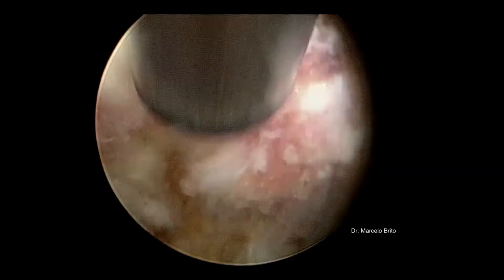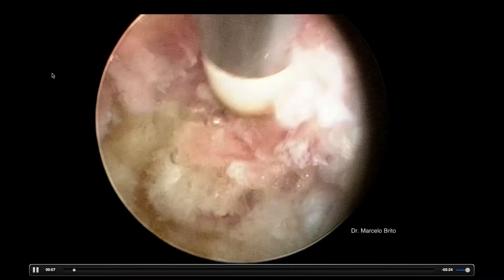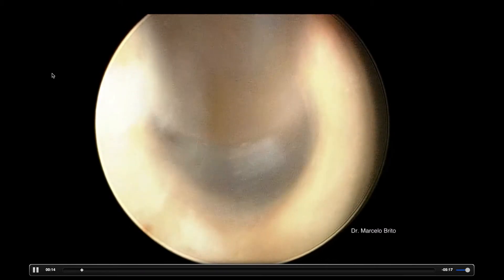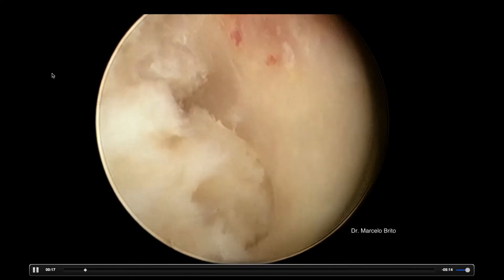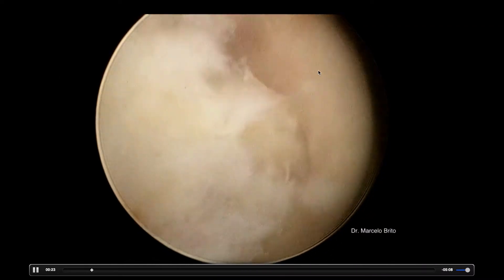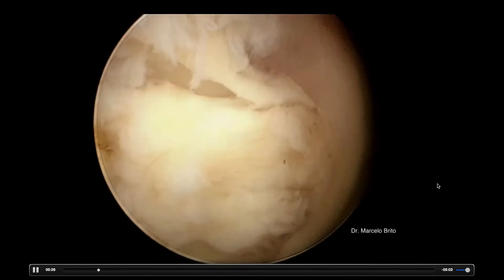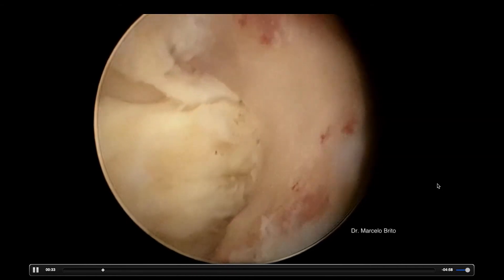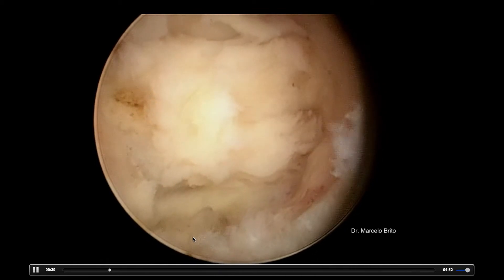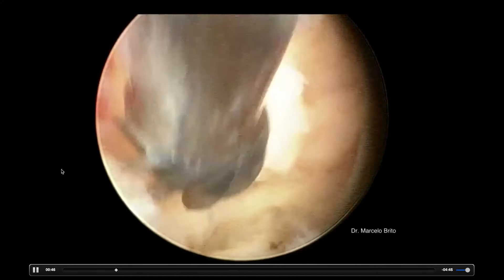This is our first endoscopic image. We're going to get rid of the soft tissues using a bipolar — we're going to coagulate vessels and get rid of muscle and other soft tissues. At 3 o'clock is the upper lamina. We are accessing through the right side, L4-L5. At 6 o'clock we have the facet joint. On the bottom of the image, the yellow ligament. And at 9 o'clock we have the lower lamina — the L5 lamina.